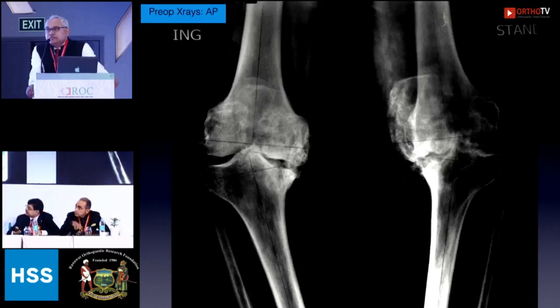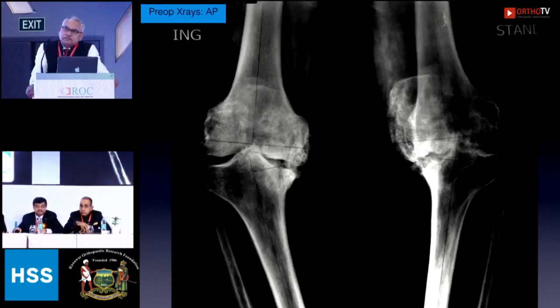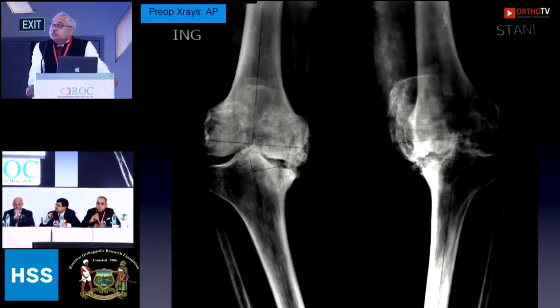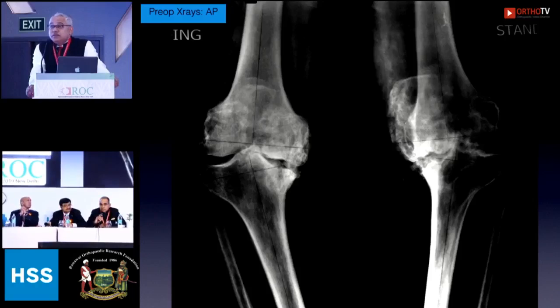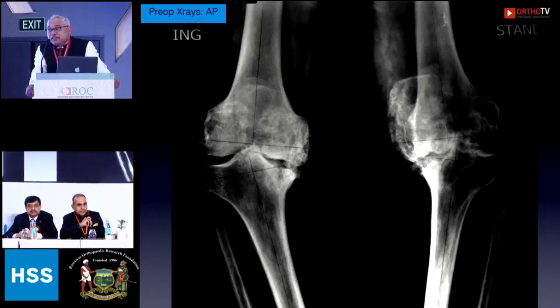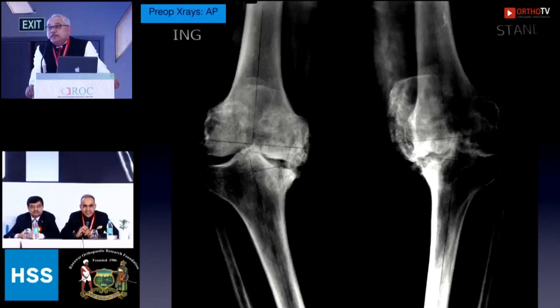So who would like to comment on the templating? Let's start with the tibial cut. Do we think that's an appropriate tibial cut? No, I think in the diagram I have drawn it a little bigger than usual. In severe deformity, one should definitely cut less, and I have cut definitely less than that. Similarly on the femur side, the cuts on both sides are a little more than what has been shown. But these cuts are drawn almost roughly 10 millimeters either side by scale without doing a reduction, hence they appear a little bigger than what they should be.